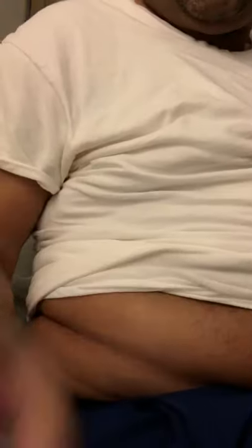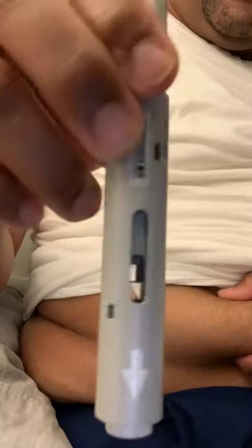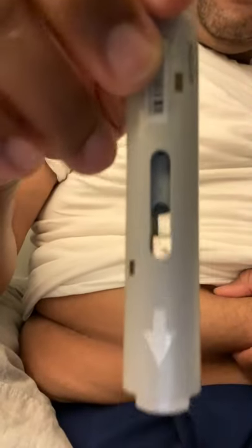What you want to do is get yourself a little bit of that belly fat. This has an indicator bar — you can see the fluid in there.